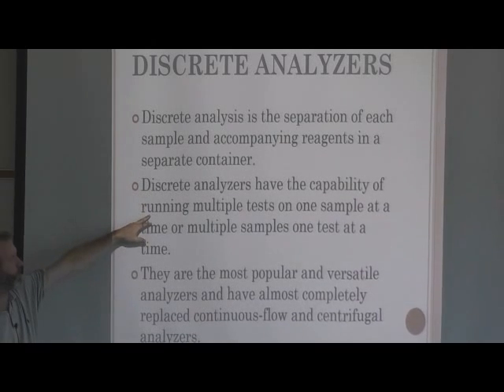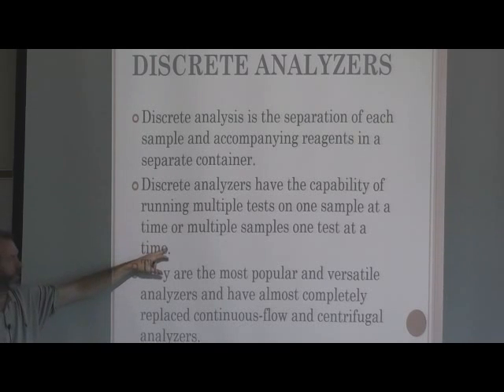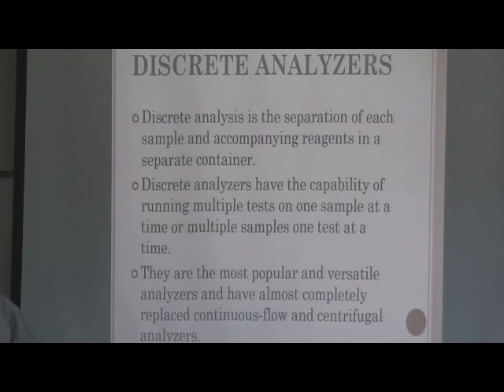And then discrete analysis is the separation of each sample and accompanying reagents into separate containers. They're capable of running multiple tests on one sample at a time, or multiple samples, one test at a time. They are the most popular and versatile analyzers and have almost completely replaced both the continuous flow and centrifugal analyzers.